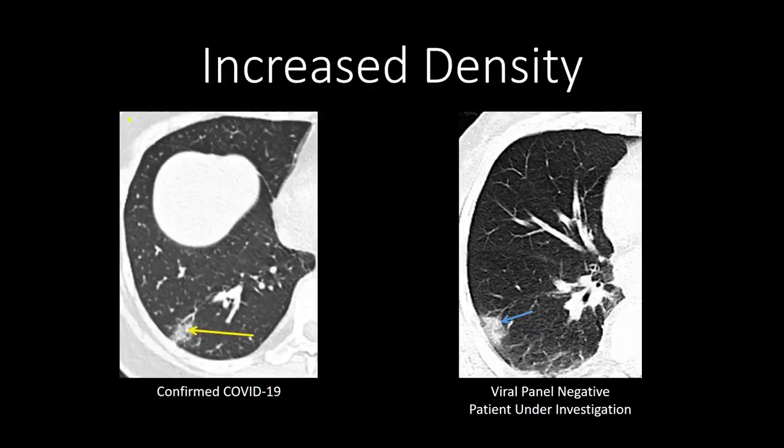In addition to traditional ground glass opacities with a rounded morphology, people presenting with COVID-19 and other viral pneumonias are sometimes reported with a more dense round opacity, progressing from ground glass opacification toward more focal consolidation. You can see it remains peripheral and poorly defined.